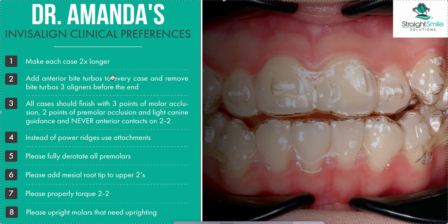Another exclusion, if they had an anterior open bite, hopefully you're not taking anterior open bite cases unless they've had OMT therapy. We've gone through that. But there's no point. It's not going to do anything wrong, but there's just no point because it's not going to work because they're not going to occlude anyways.